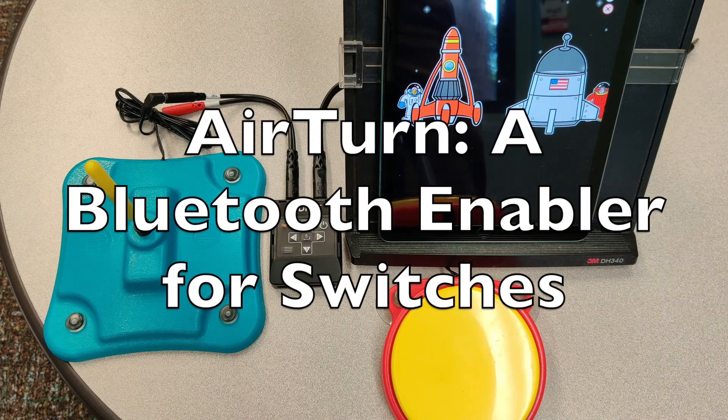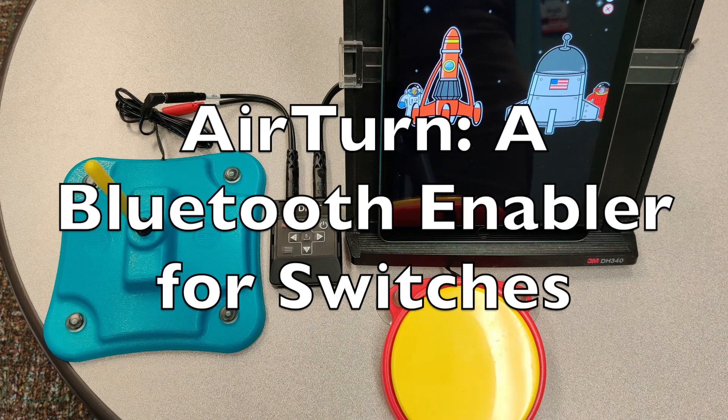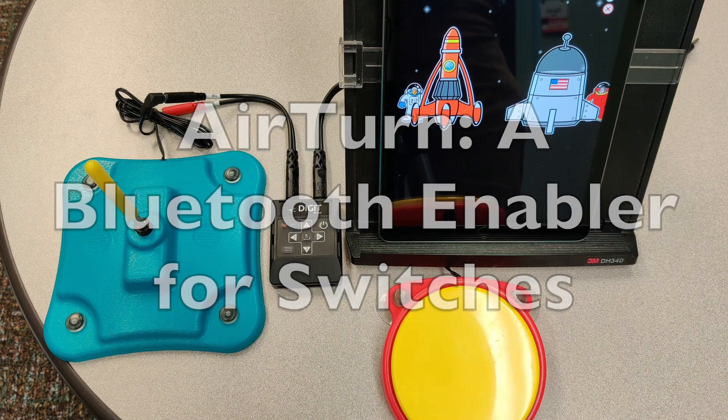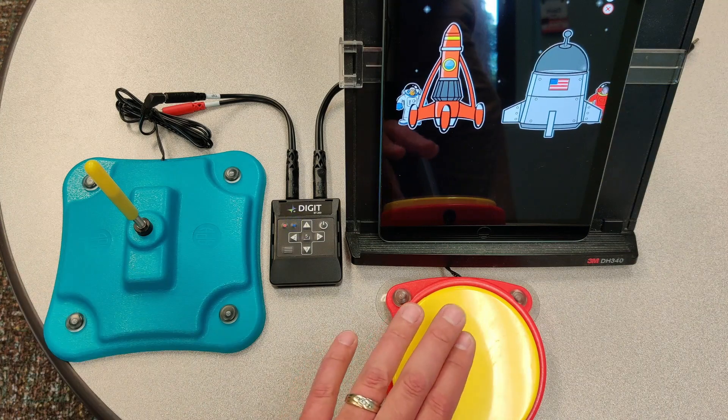Welcome to AirTurn and wireless switches. Today we're going to look at Help Kids Learn and how we can integrate some of our old switches with some of this new technology. Blast off with us.